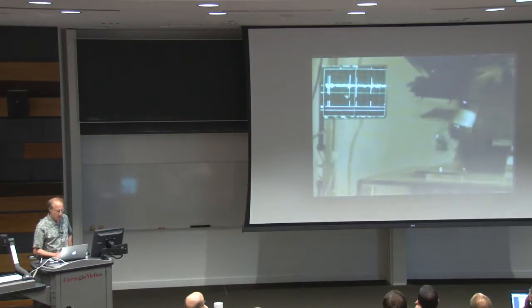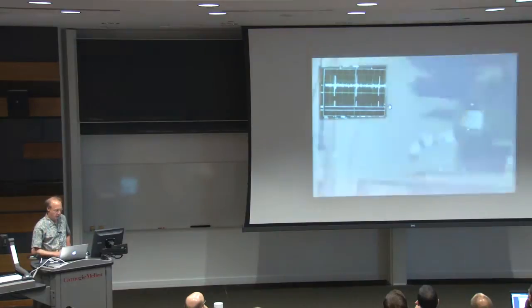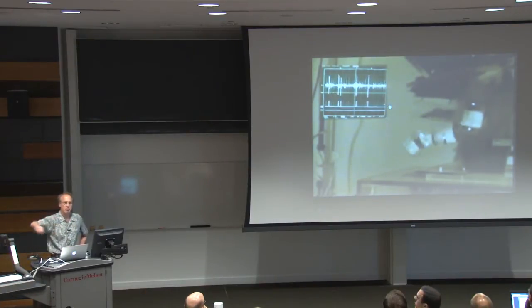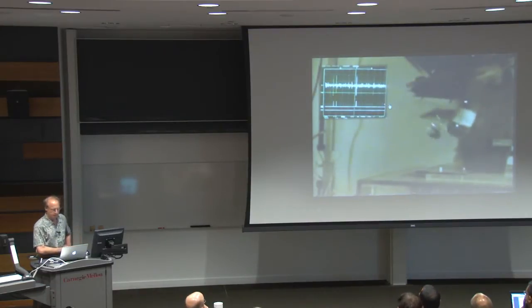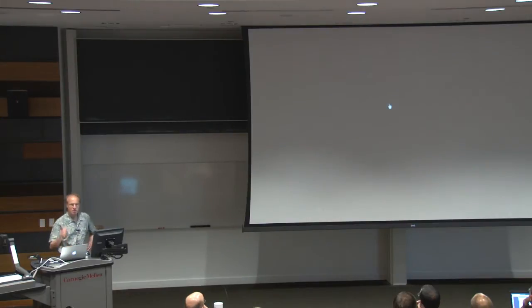So this is an action potential on an oscilloscope. You can hear it fire. And as the animal moves its hand, you can see this firing take place in a specific way. So you hear this neuron burst every time the animal moves its hand upwards. When he moves it downwards, it stops firing. And when he just holds it steady out in front of him, there's a background firing rate. You see, it's very robust. It's a nice clean signal. You're watching action potentials from a single neuron.